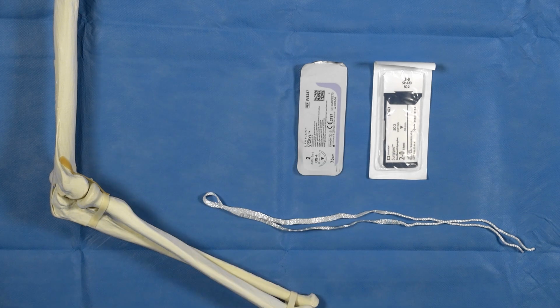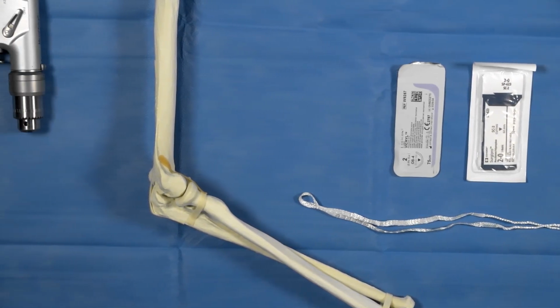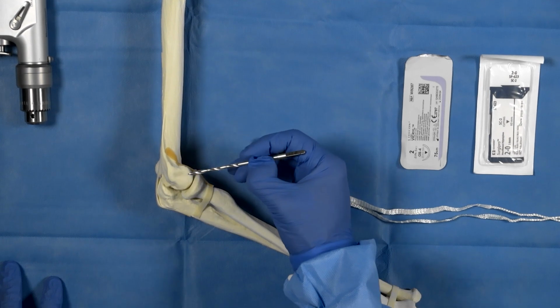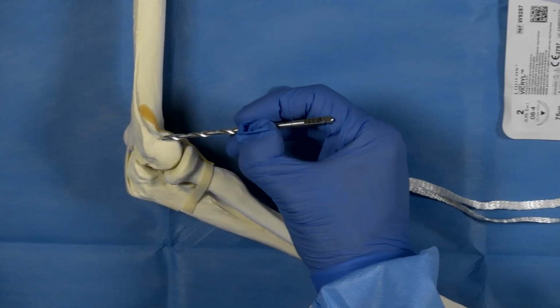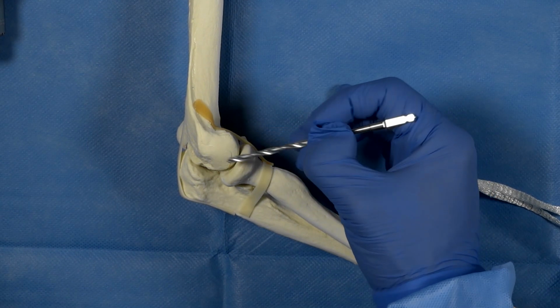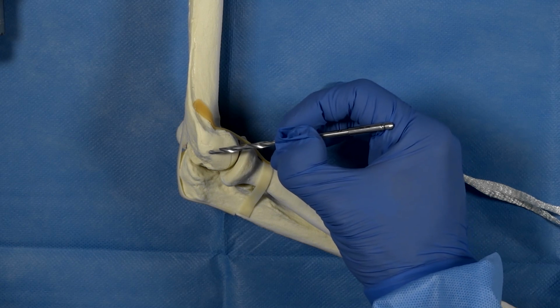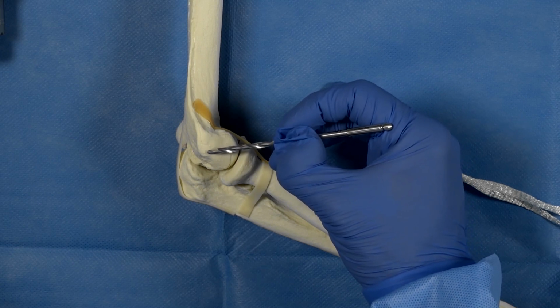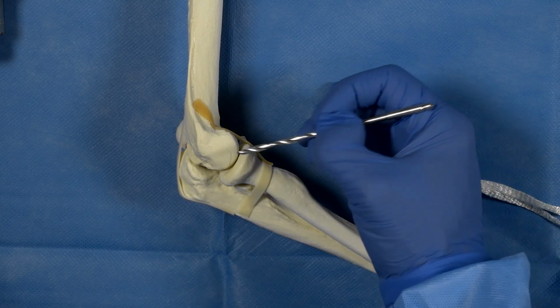In terms of our positioning of our bone tunnels, there are going to be humeral and there are going to be ulnar bone tunnels. The humeral bone tunnel is often talked about as being at the center of the circle that makes up the capitellum. In reality, the center point of the lateral ligament complex is slightly posterior to that. It's about 2 millimeters posterior to that.